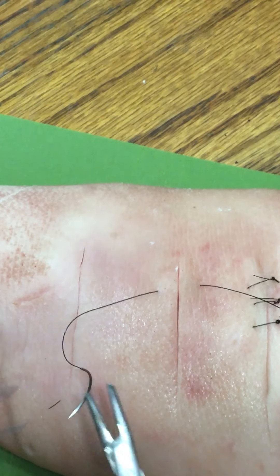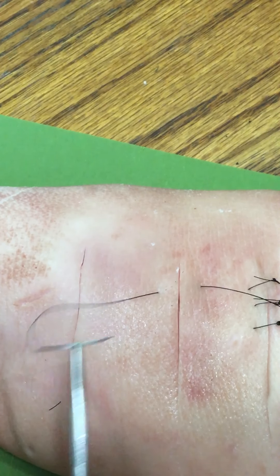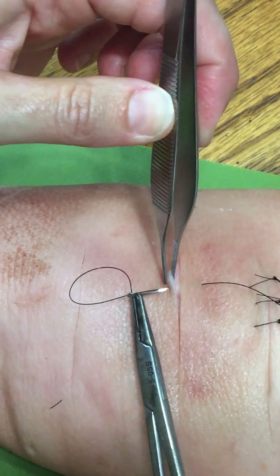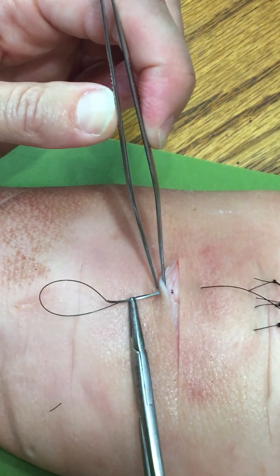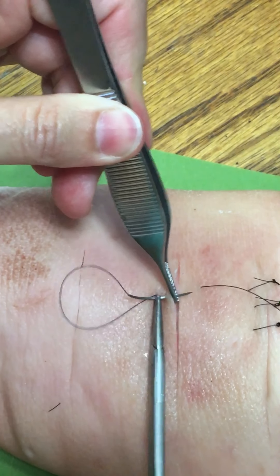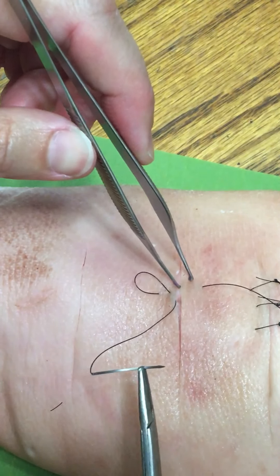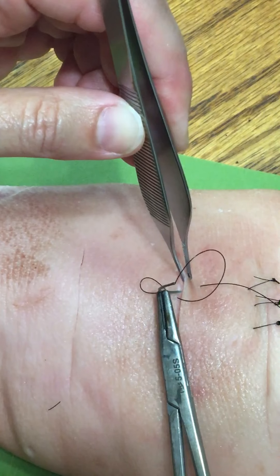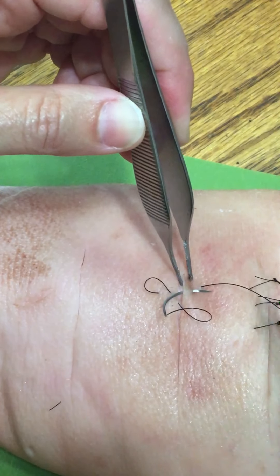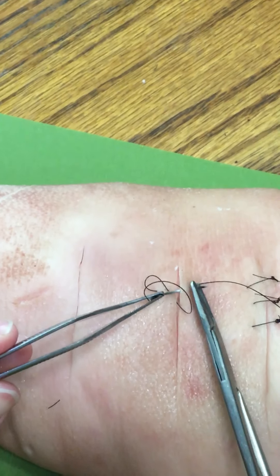I'm going to load the needle backhanded, and this time I'm going to go shallow with the stitch. You can see that I'm coming out just below the skin there, and I'm going to do the same thing on the other side directly across from it, at the same depth from the edge of the wound.